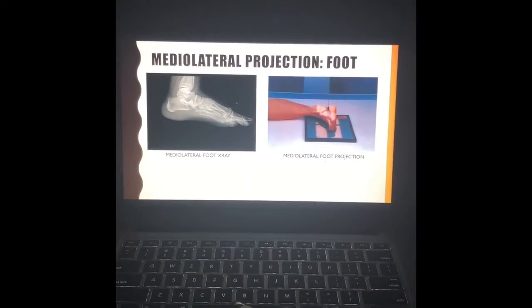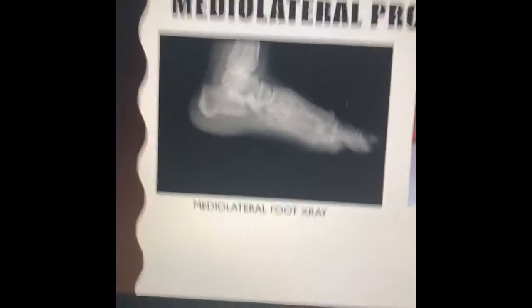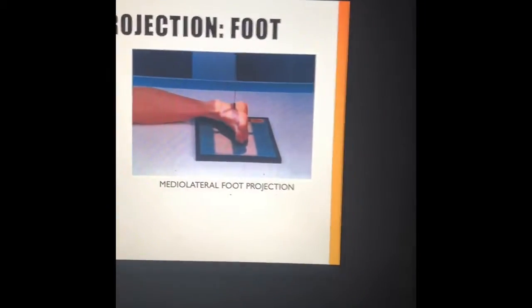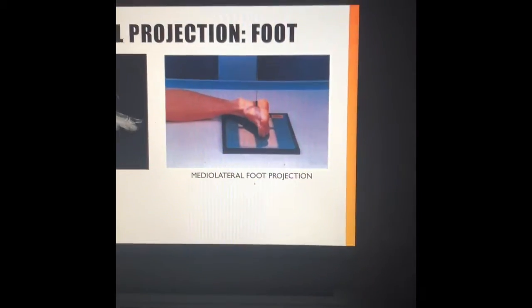Medial lateral projection of the foot. This is a medial lateral foot x-ray. This is a medial lateral foot projection.